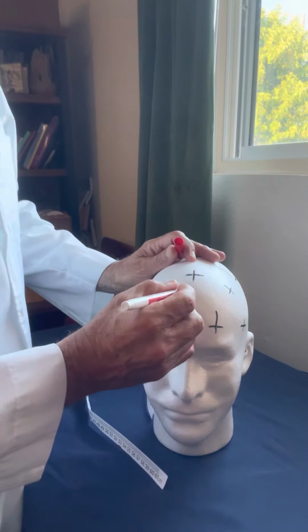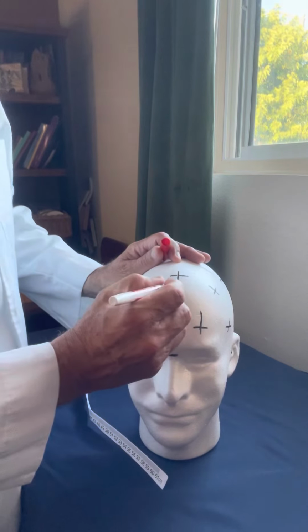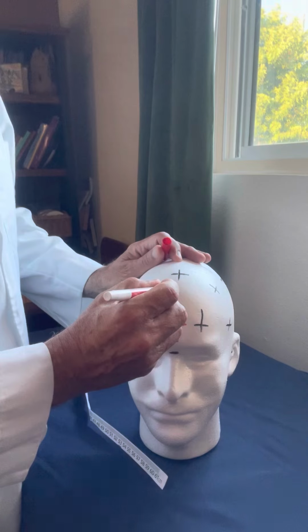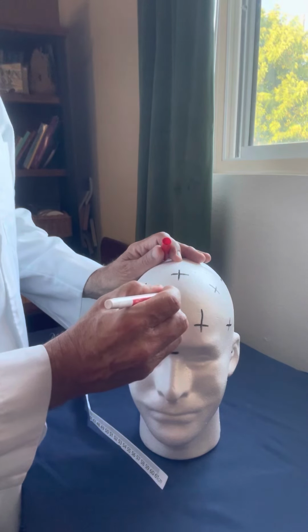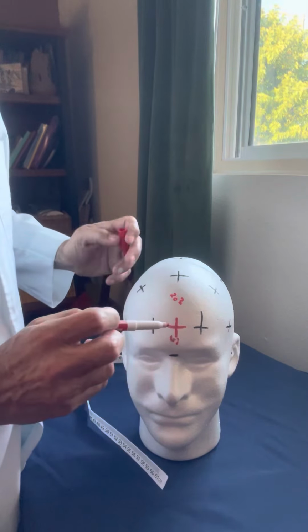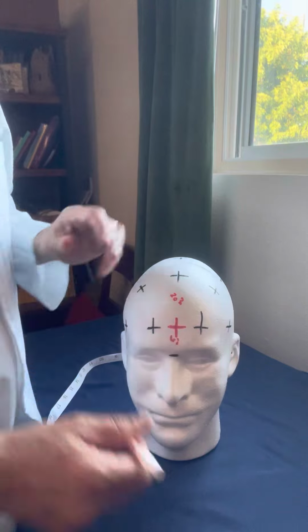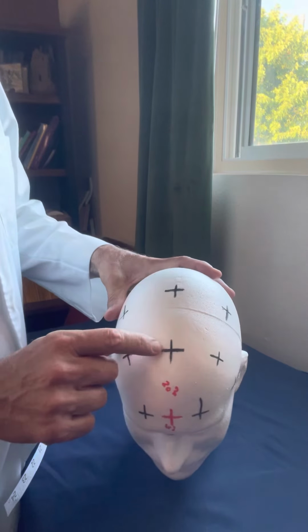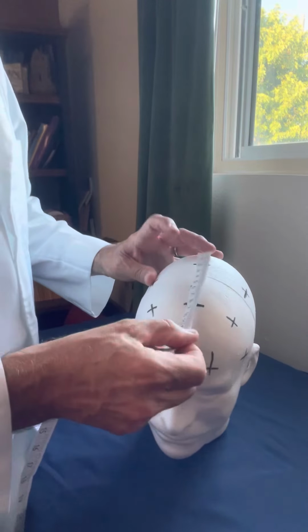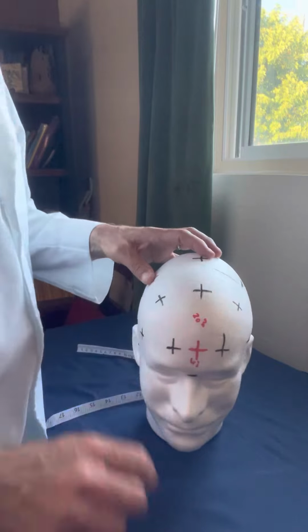And we're going to discuss the error rate in class. So actually, I'm going to do a video to go over those sheets, and you'll see how that works. So it's 20% of the nasion to inion distance from FPZ to FZ, and it's 20% from FZ to CZ. So let's see what I have here. It's 6.9.